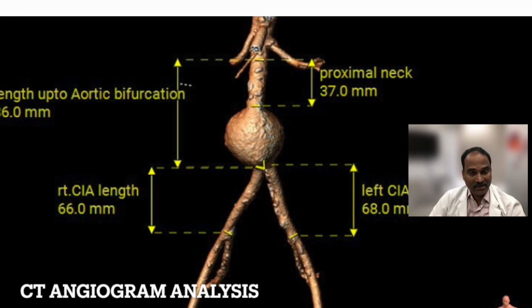So one blessing in disguise in this case was the aneurysm was extending up to the bifurcation, so that's very key in this case, because when you're taking an aorto-bifurcation aortic graft, your bifurcation segment of the graft would sit here, and if the aorta below the aneurysm or just above the bifurcation was 14 millimeters, then the expansion of both extensions, ipsilateral and contralateral gates, becomes a big issue, and that's the reason in this case this was a blessing in disguise, the aneurysm extending up to the bifurcation.